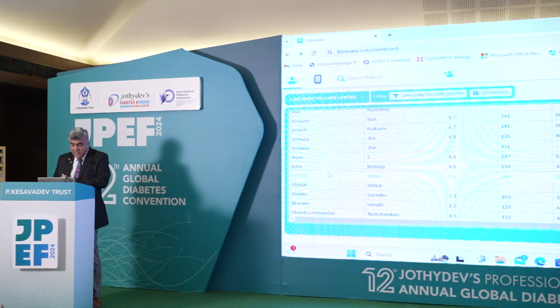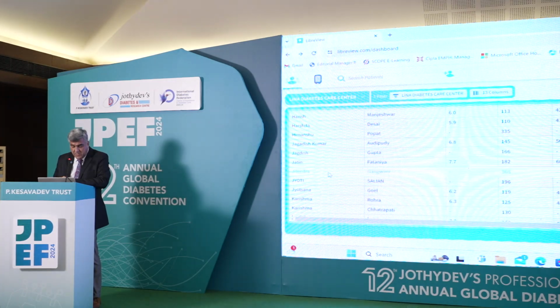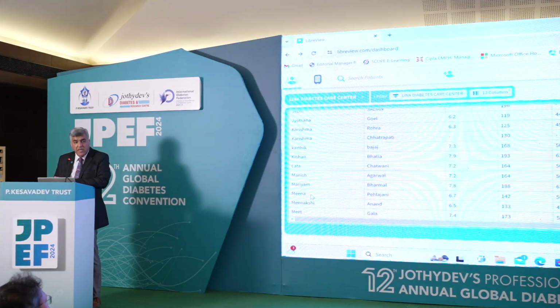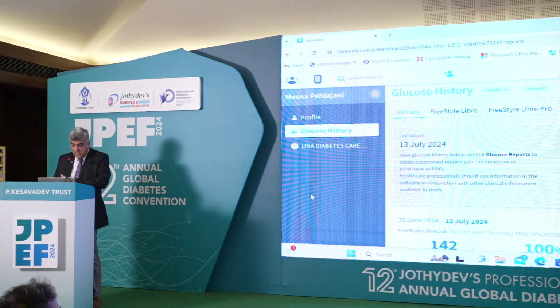So let me take an example. All these patients remain connected with us. Let me choose one which I remember is doing it more continuously. So this is how your dashboard would look at your clinic or on your laptop. We can do it from anywhere and do this consult also.